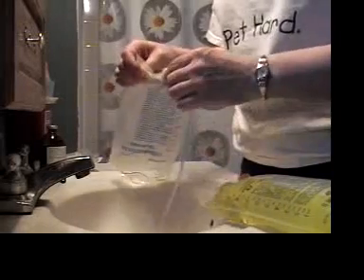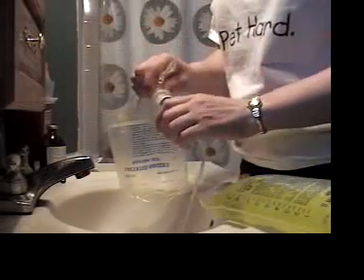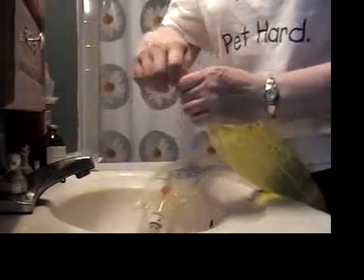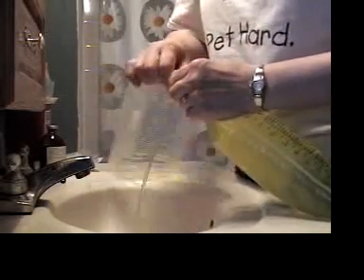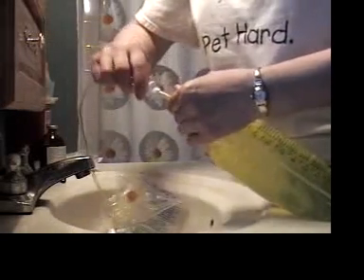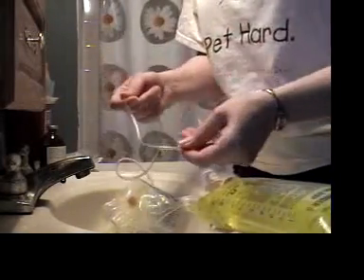That's okay, provided you've been very, very careful that the ends of your line have not touched anything to introduce any bacteria. I've been careful, so I'm going to reuse this line. So I simply remove the white cover from the bag of fluids. Then I carefully take my line, remove it from the old bag, and insert it into the new bag. That's it.